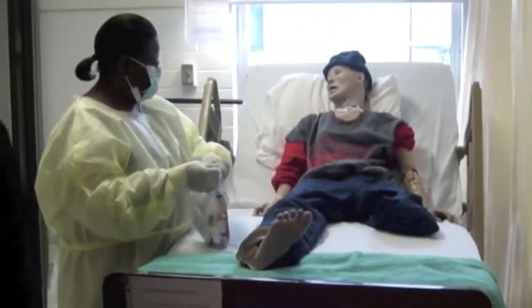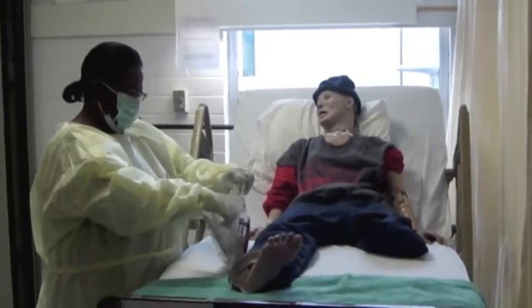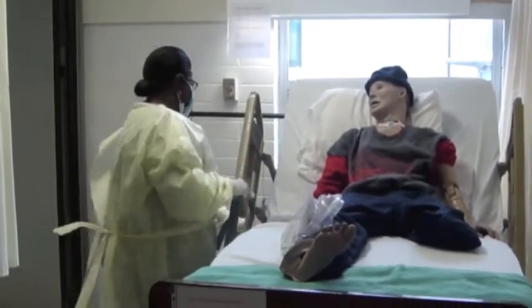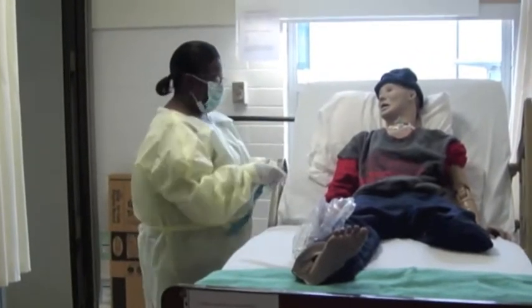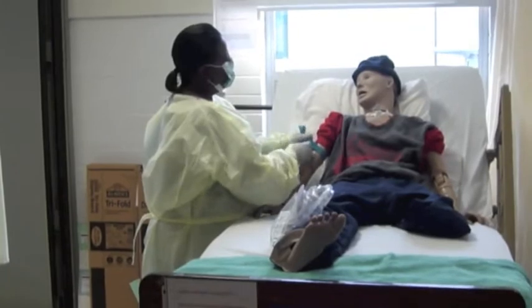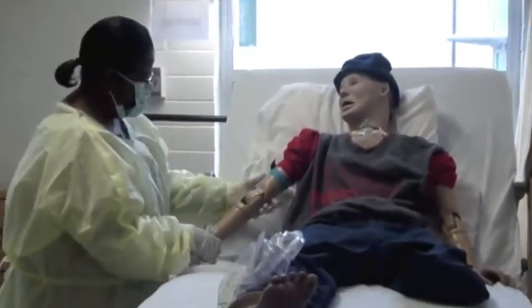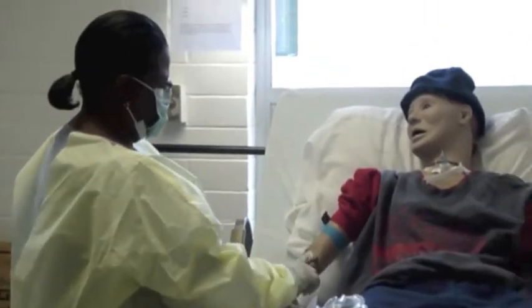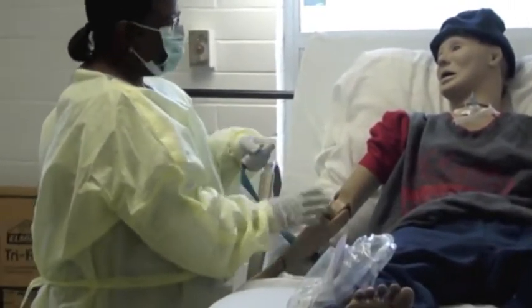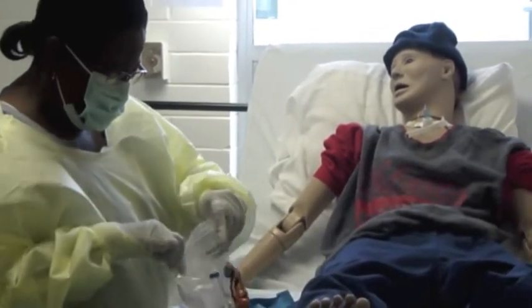And again, you definitely want to be organized. You want to work quickly, but accurately. Hello, I'm going to tie this tourniquet on and try to feel for a vein, okay? How are you doing today? I'm sick. That's why I'm here. Okay. Alrighty. So I feel for the vein.